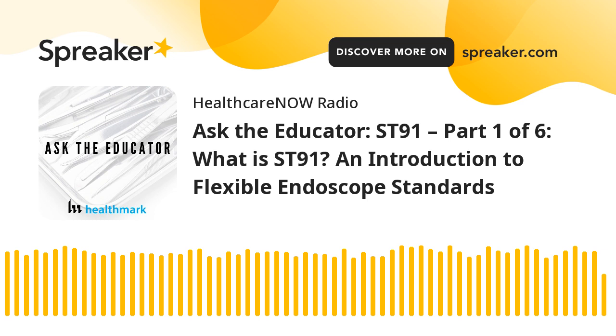And the next tier down is a may, and may just means that you have permission to do that within the standard. So you may be doing it, you may not be doing it, but if you choose to do it, you have permission to do it. And then a can simply means you may have the capability in your facility to do that. It may be possible, but we're not giving a recommendation either way. So I hope that helps clear up, but really pay attention to the words. And I like to say that this helps give you not necessarily a timeline, but a hit list. Okay, this is a must.